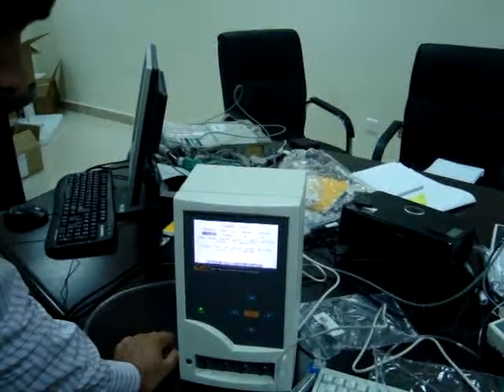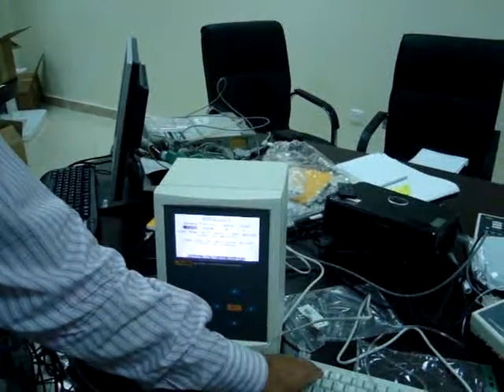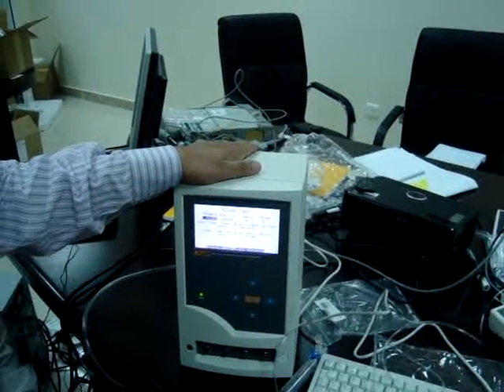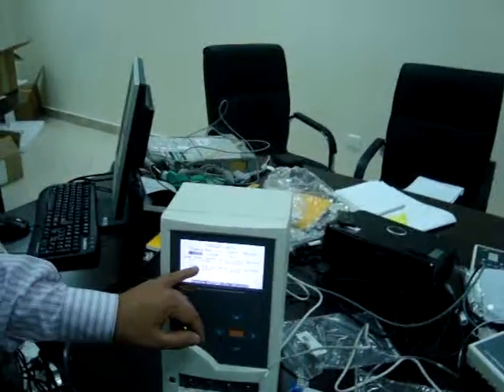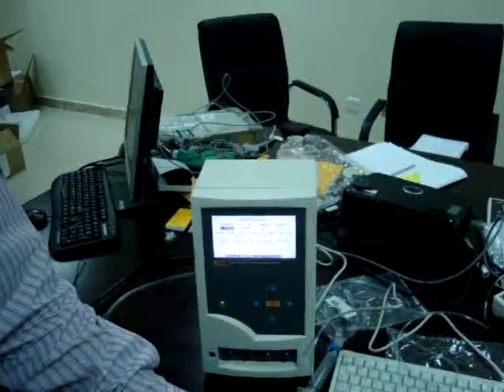You already connected? No. Because there is software, that is for the computer. You can do computer printer, or you can connect direct. There is a software called Hydrograph. So we'll connect. This is not for computer, this setup is for printer. Yes, I know. But the Hydrograph is computer. Yes, we'll connect it.